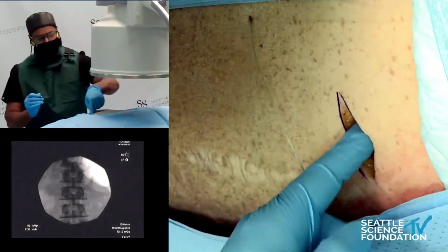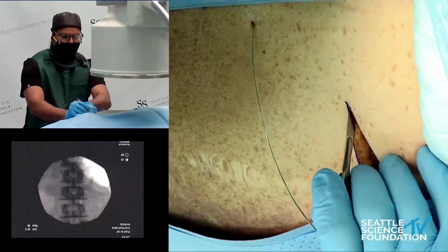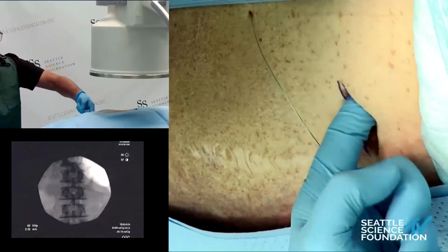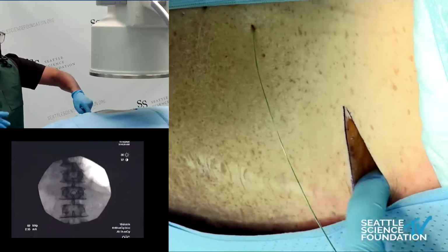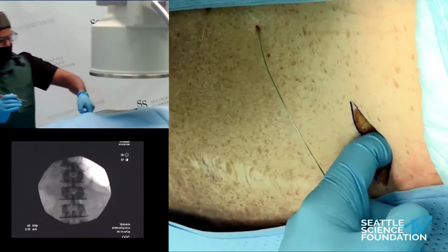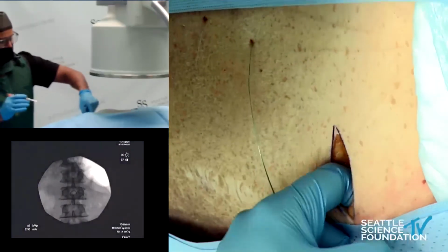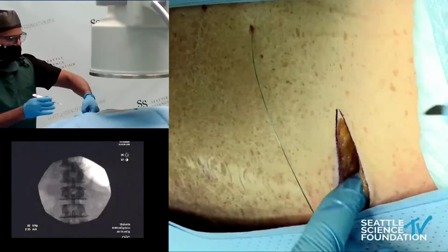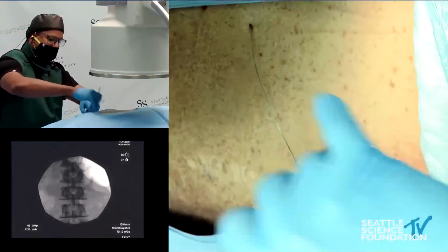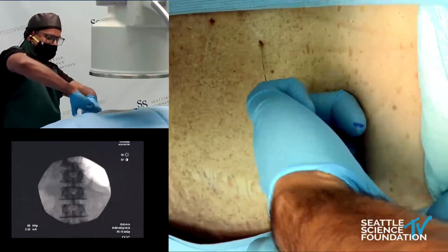Okay, and then you'll get the adipose here. You can do a couple things here. I usually use a little electrocautery, make sure I have hemostasis. With these non-rechargeable systems, you can get down to a depth of 2 to 4 centimeters. You don't have to be superficial because you're not going to be recharging them. So once I find a nice plane below Scarpa's, I just try to feel a nice plane that I'll develop out. Again, I would usually use electrocautery. We don't have this here, but that's okay. I'll use my blade and then finger dissect. You can also use a Metzenbaum to do the same.